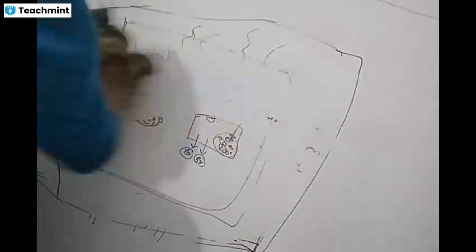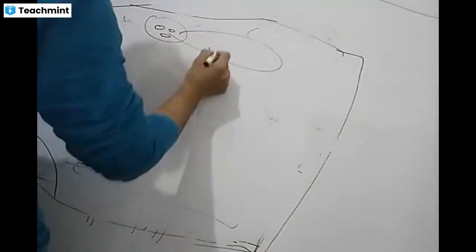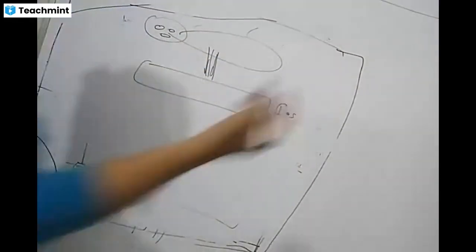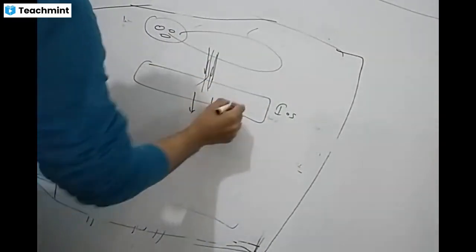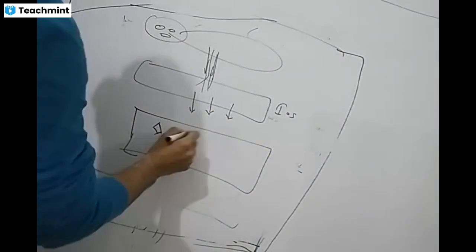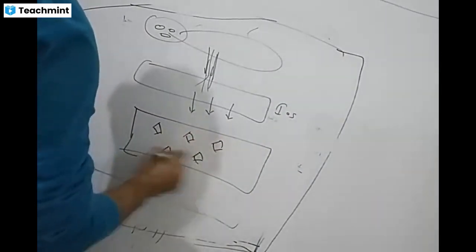So if we look at the condition of our film, we started with the patient from which the X-ray was coming. Suppose you are using screen film, there may be an intensifying screen. It will come, and what will come out? Light photons. Then we have our emulsion. The emulsion has many crystals. These are the crystals.